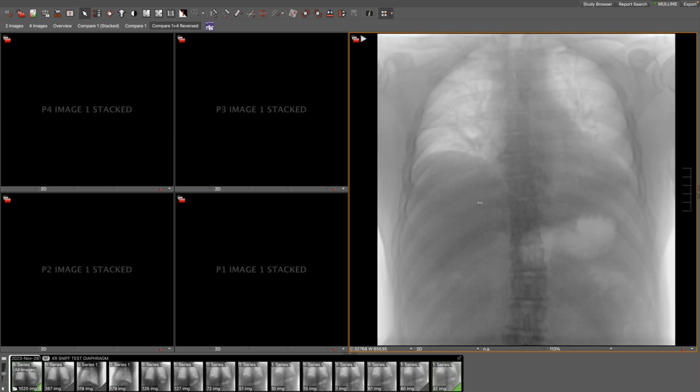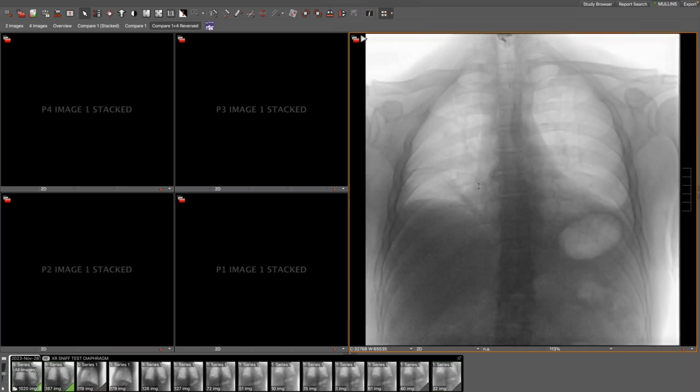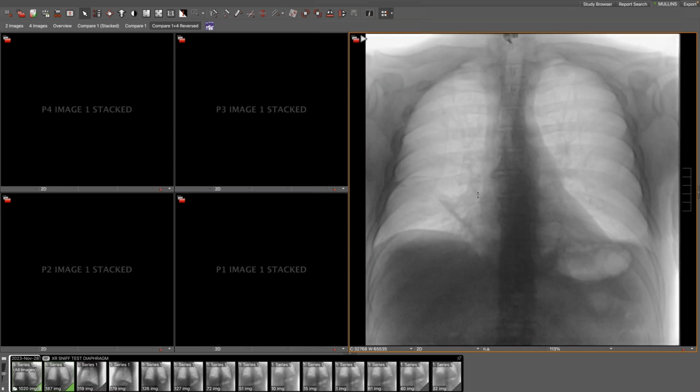So his diaphragm is completely paralyzed on both sides, despite the fact that on standing, it looks quite normal. He takes a nice deep breath when he stands, diaphragm goes down, chest wall goes up. This is because he's using his abdominal muscles without being aware of it. He tightens his abdominal muscles, and that pushes the diaphragm up. When his abdominal muscles go in, it pushes the diaphragm up. When I ask him to take a deep breath, he relaxes his abdomen, and the diaphragm falls passively.